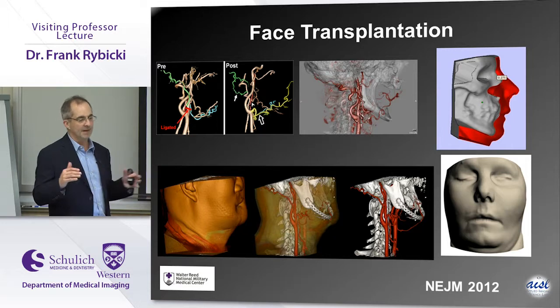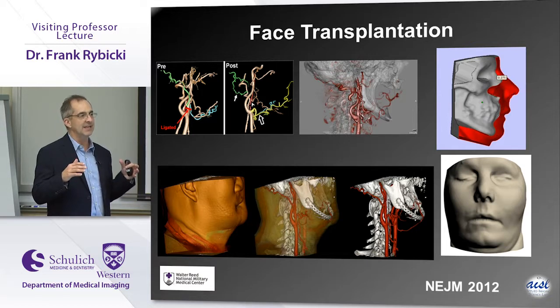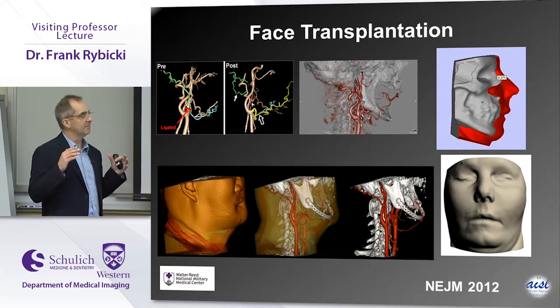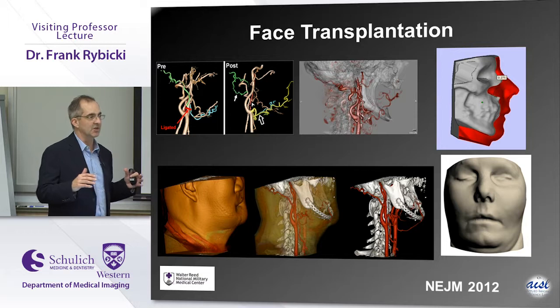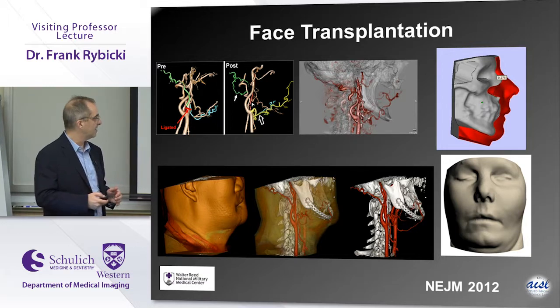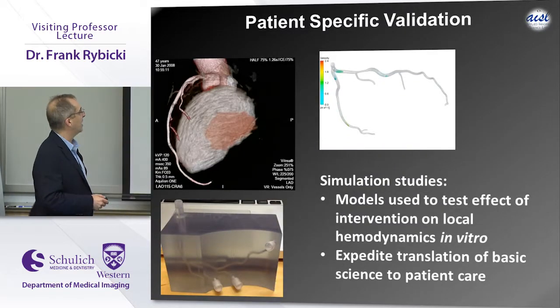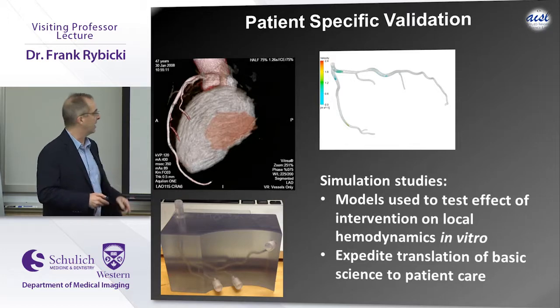There's a pretty extensive literature that shows that if you actually use medical models in these surgeries, you will not only have better outcome, but you'll save a ton of time and a ton of money and just operative time. Right? So it's unquestionably highly relevant. You can also use 3D printing for physical experiments as well.